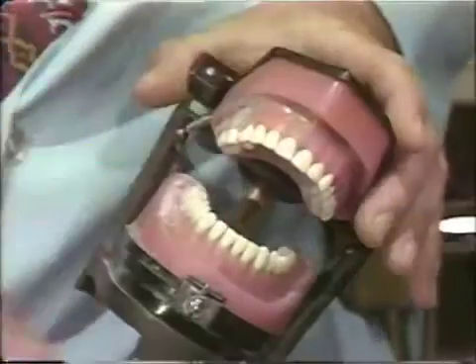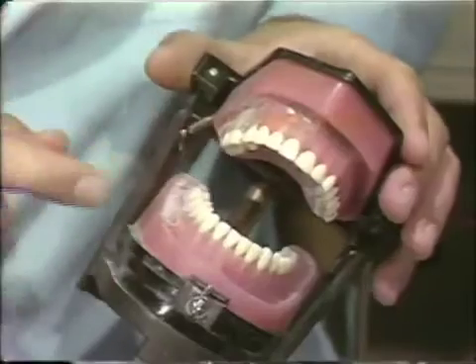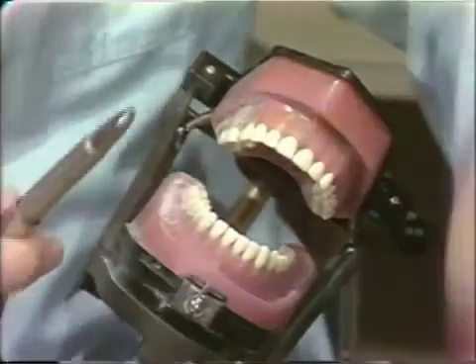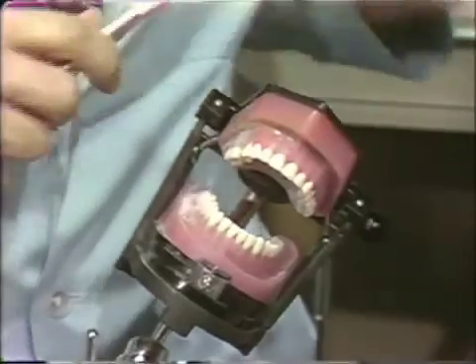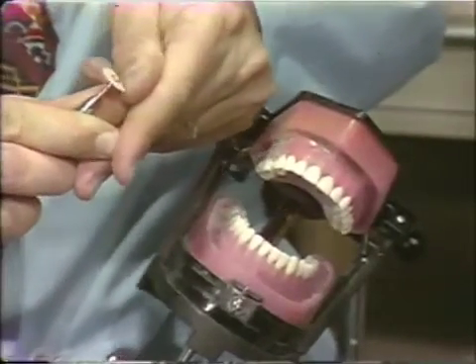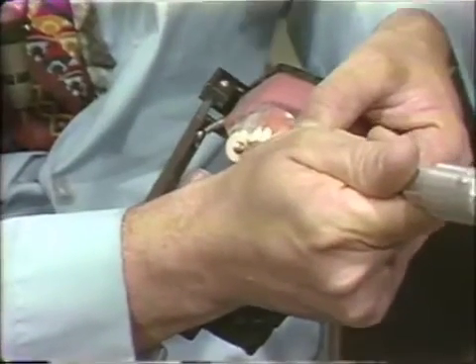Now the only thing left to do is to use a sand disc to remove the roughnesses, and then we will be finished. We will use a medium sand disc and again we will soften the disc on the fingernail — not on the abrasive side but the paper side — and then we will use this to remove the roughnesses created by the diamond instrument.